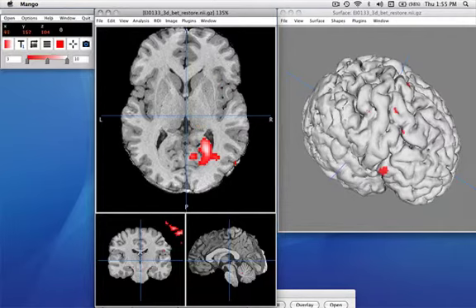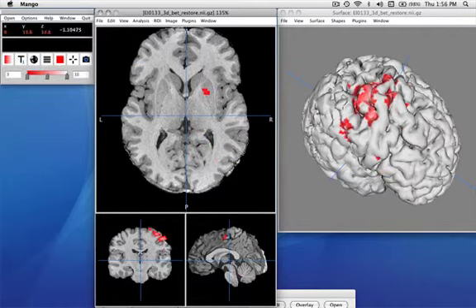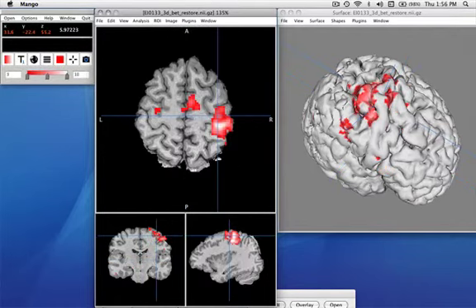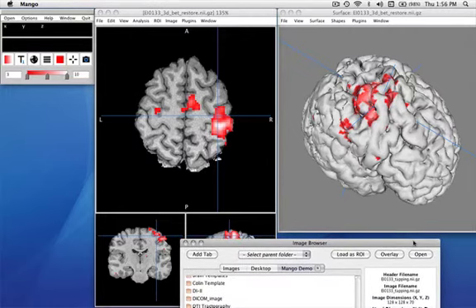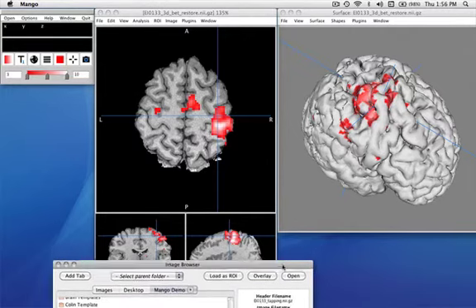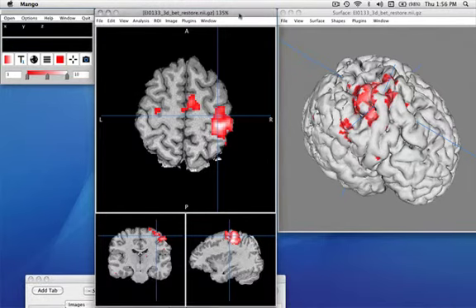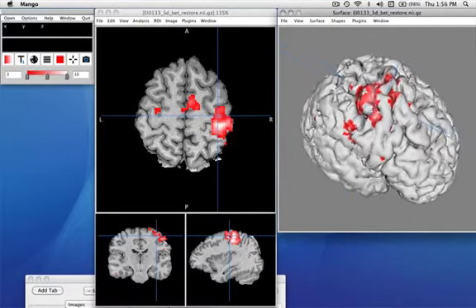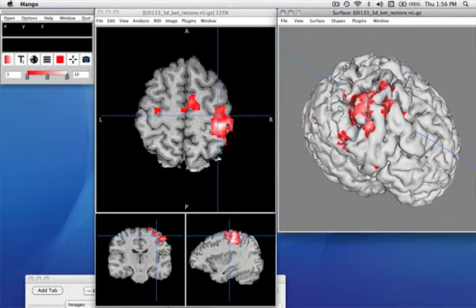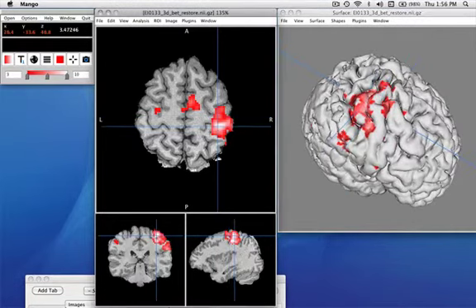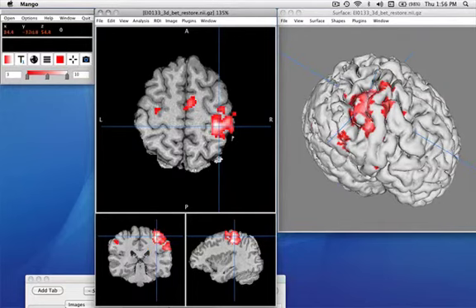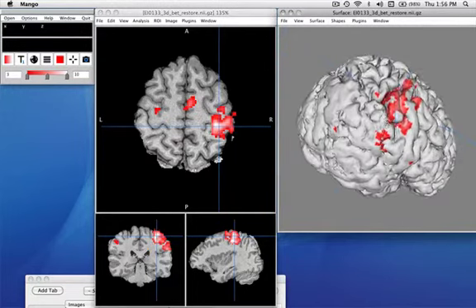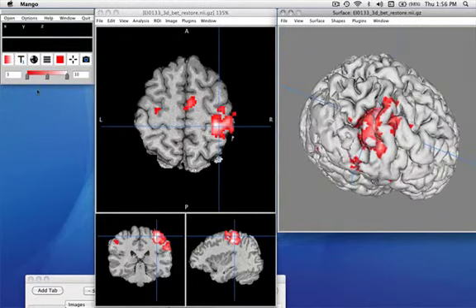That's part of what needs to be done. Now we need to move from image space to world space, so that both sets of overlays from both images are now in register in world coordinate space. We can see that we have the overlay here and we have the activity here — one from a lower resolution device, and the surface from a higher resolution device.